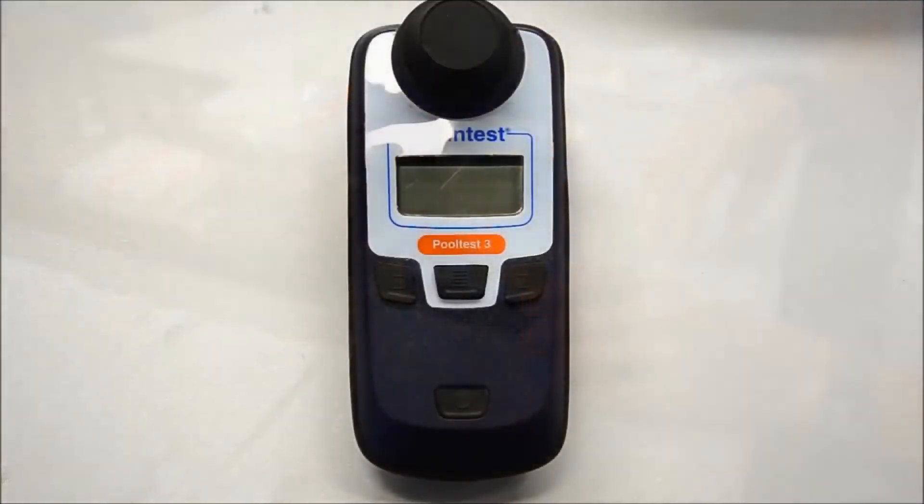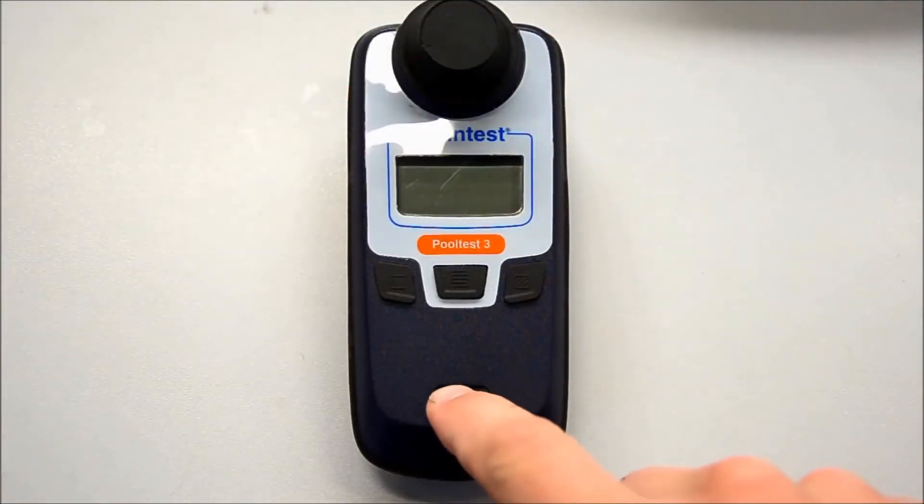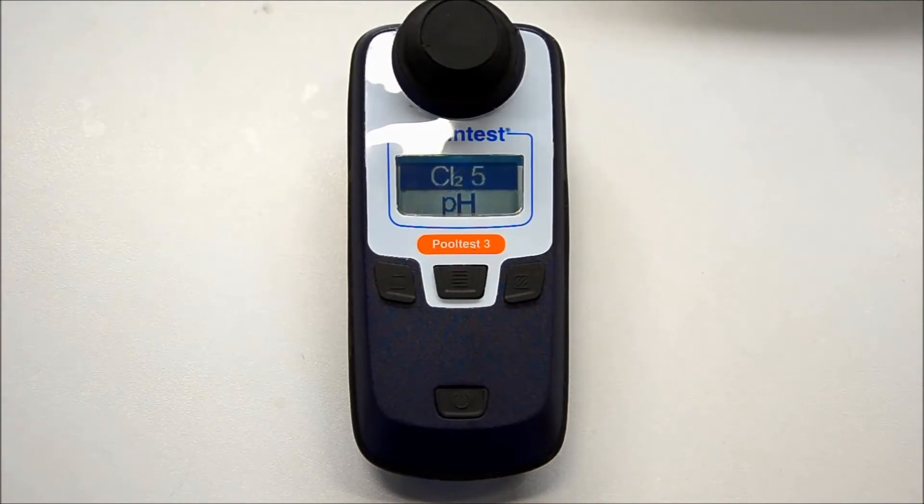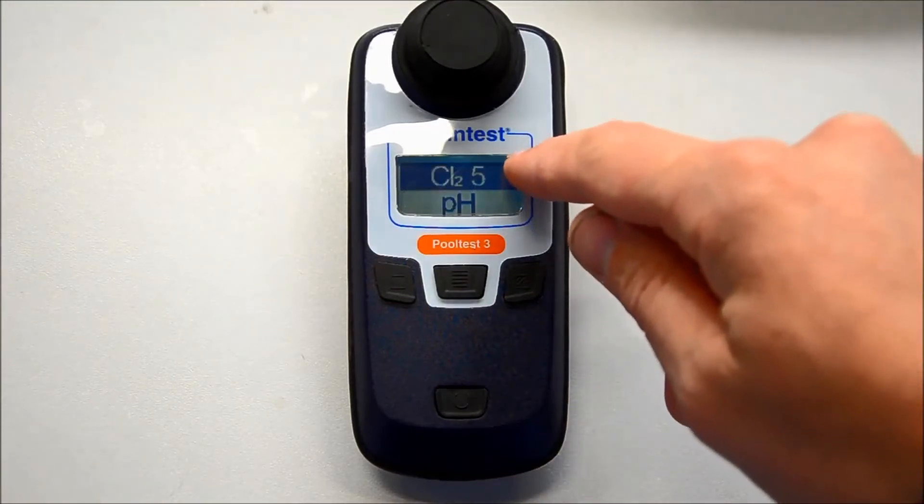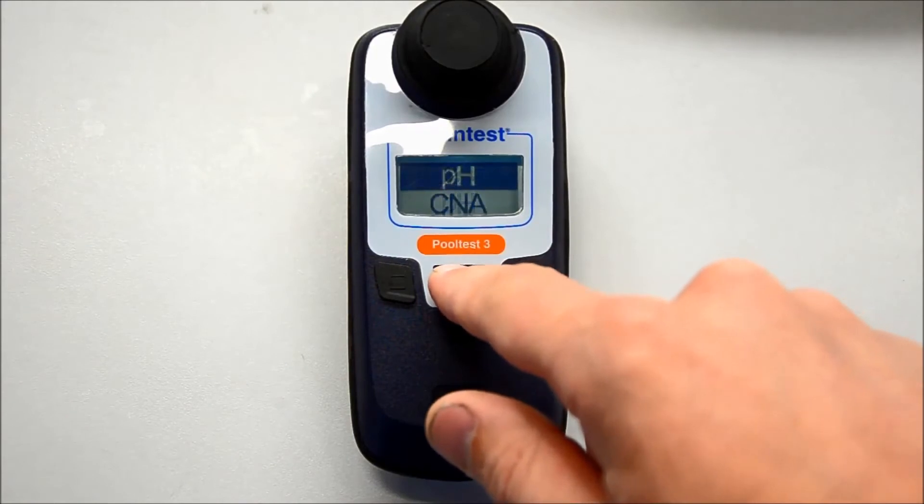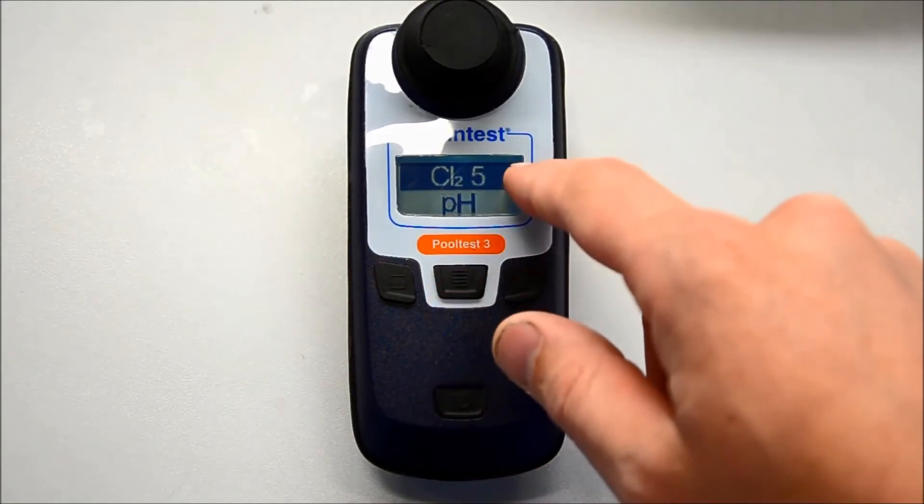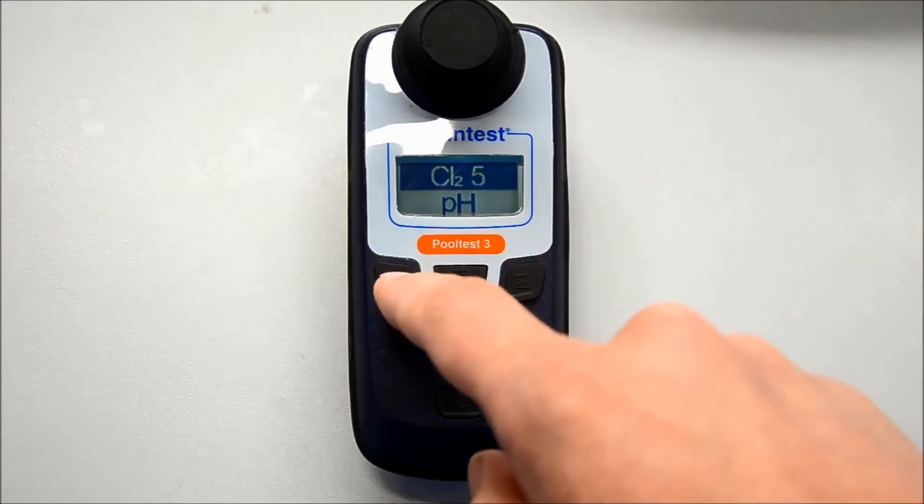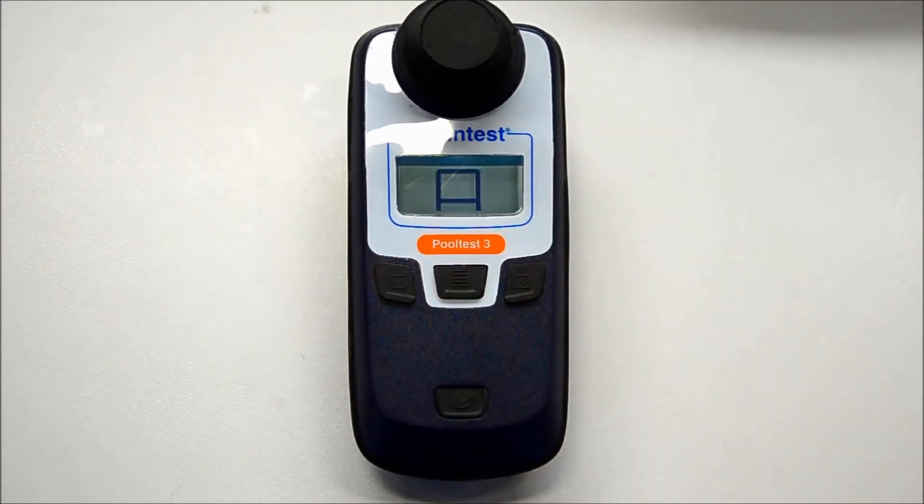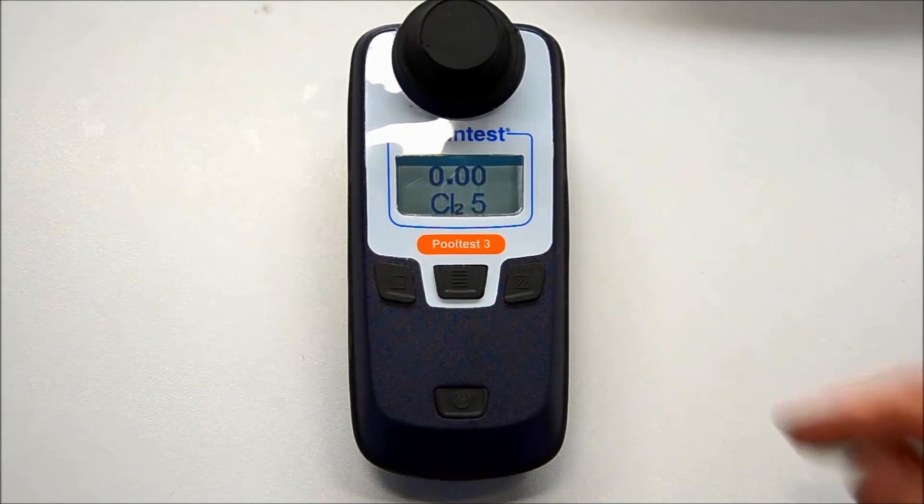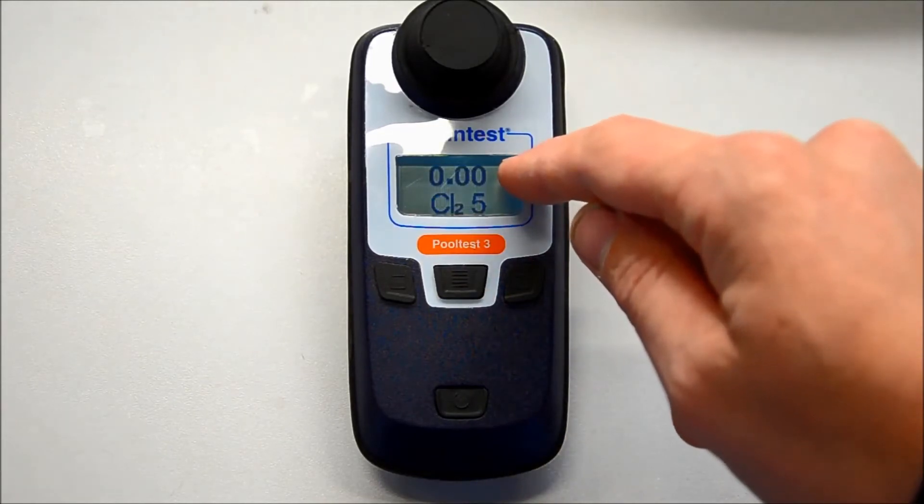We turn on the pool tester. Make sure that CL2-5 is highlighted. Then press the left top button to make a clear water reading. Now the pool tester is calibrated for clear water.